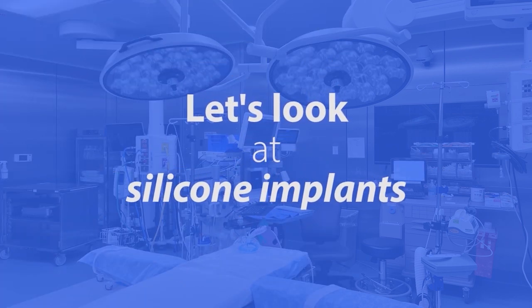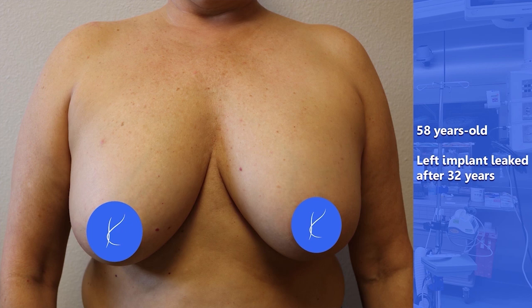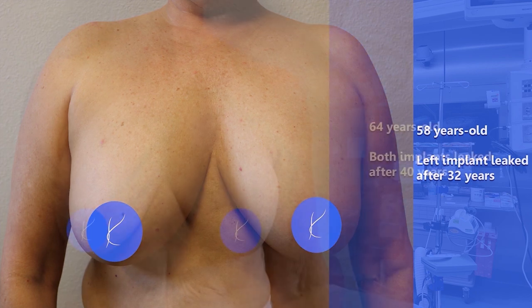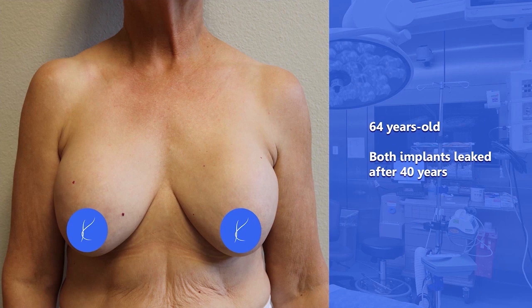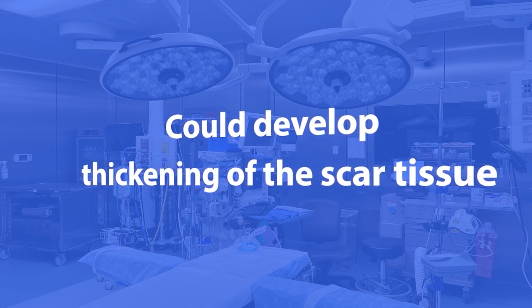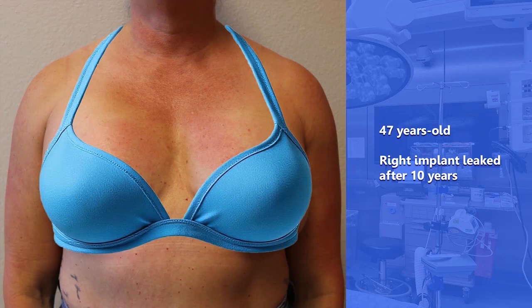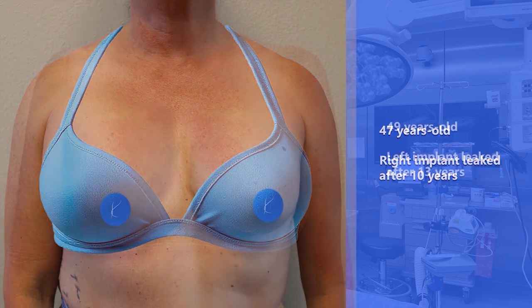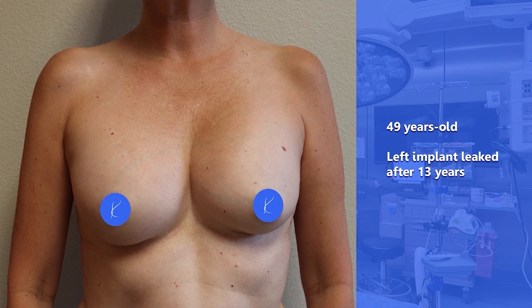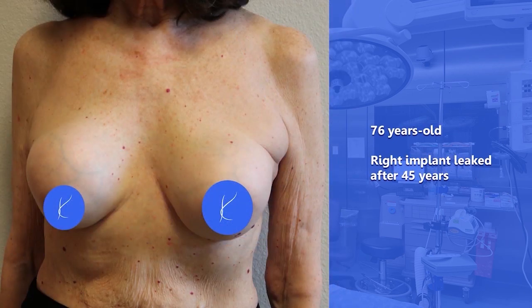Now let's take a look at what happens with silicone implants. When a silicone implant leaks you might not notice it, like in this 58-year-old woman who had her implants for 32 years before a leak was discovered in her left breast implant. Leaks were discovered in both implants of this 64-year-old after 40 years. You could develop thickening of the internal scar tissue like we talked about — in that case the shape of the breast may change, as in this 47-year-old whose right implant leaked after 10 years. It's easier to camouflage that than with a ruptured saline implant. Here's a 49-year-old whose left implant leaked after 13 years — it's kind of easy to camouflage for a while. Here's a more extreme example of capsular contracture, the thickening of that scar tissue. This 76-year-old woman had her implants 45 years before a leak was detected on the right side.